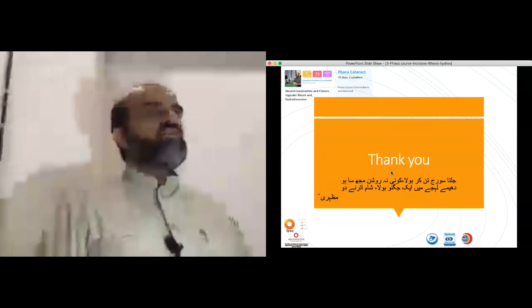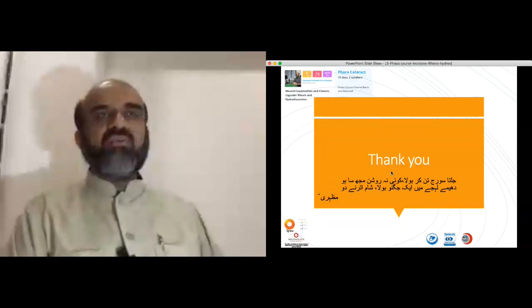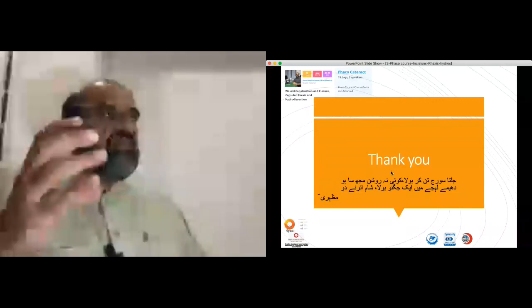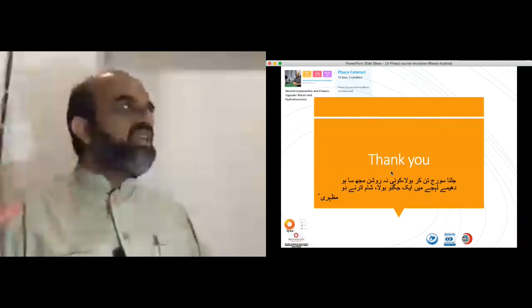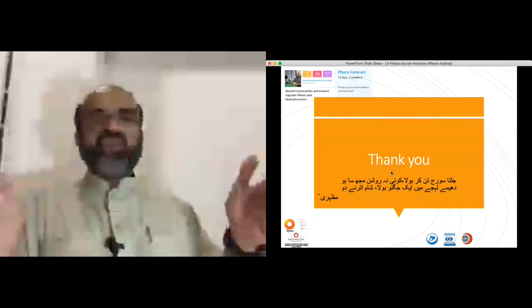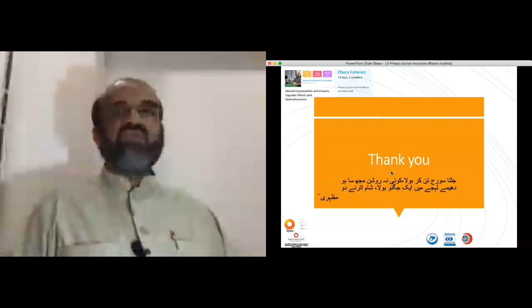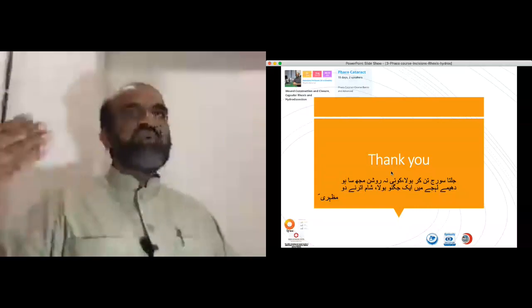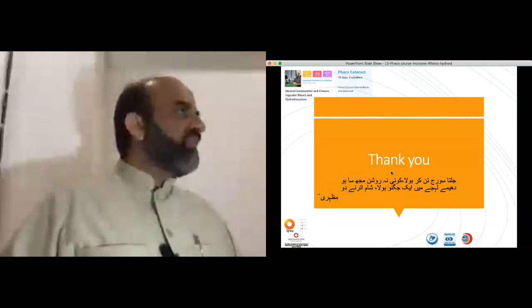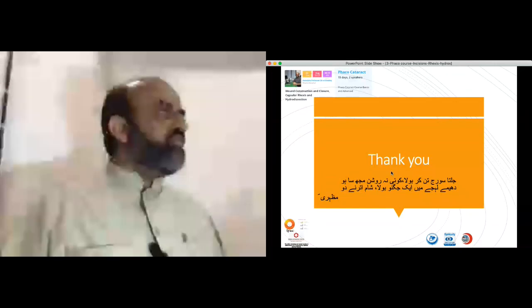The tunnel is about plus minus 2 millimeters. Dr. Akram has asked about the length of the tunnel which we construct during placement of the phaco incision. That's what the square and rectangular incision is meant. Square incision means that the width of your incision is equal to the depth of your incision. If your keratome is 2.75 millimeters, ideally you should be about 2 to 2.5 millimeters into the cornea for the ideal depth. If it is 2 millimeters, it is rectangular. If it is 2.5 millimeters, it is almost a square-shaped incision.